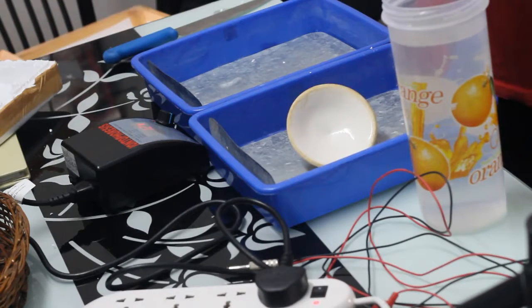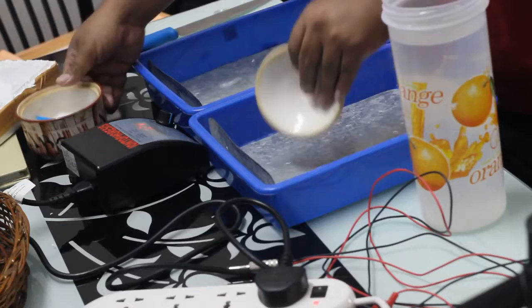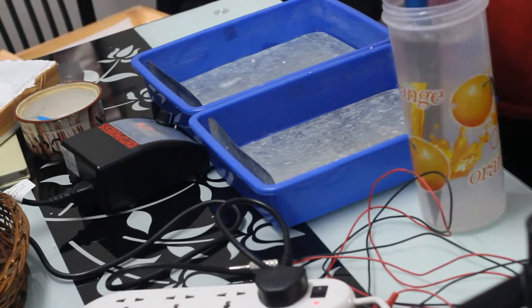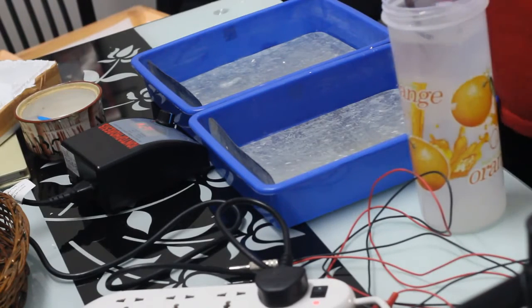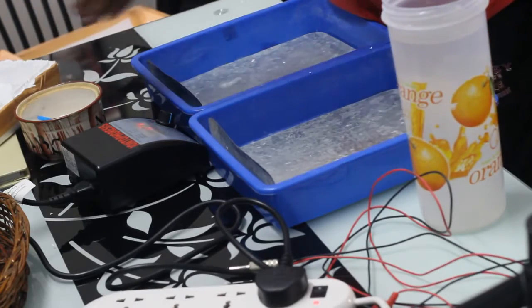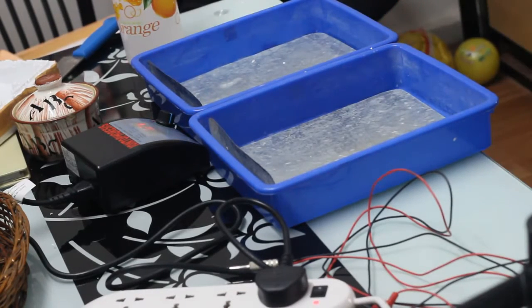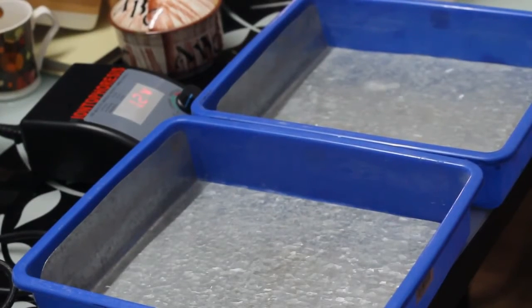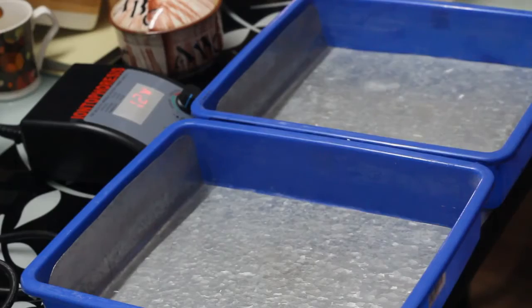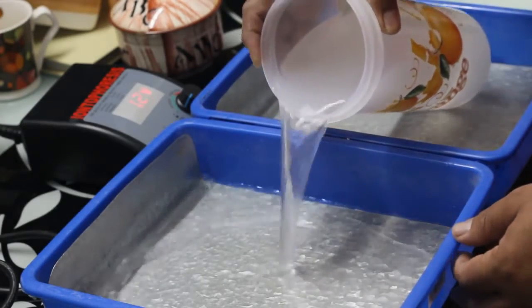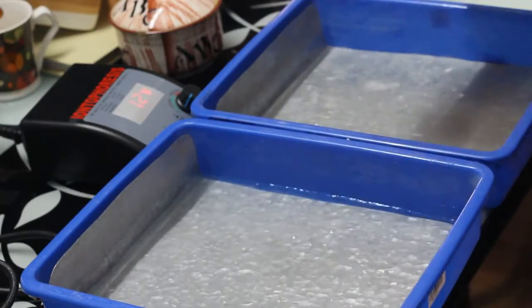Now I'm going to take the salt and dissolve it into the water. This is a salt solution. I have mixed it in 2 liters, at least 5 tablespoons to make it a little salty. For hyperhidrosis treatment, the salt solution is important, which will give you extra boost when you take this procedure for the palms and feet. There is a minute sort of electricity that will pass through your sweat pores. Once this passes from your sweat pores, your sweat glands will get shrunk and blocked. Thus in 45 days, your palms or feet which are sweating will completely get dry.